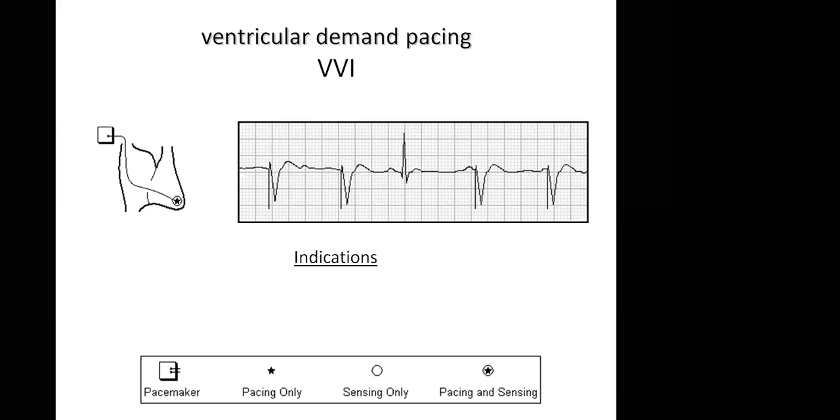The P, okay, there's something about this P. The first, did I get it right? Okay, the first PR interval is quite prolonged before the next pacing. Before the refractory, before the intrinsic activity. And then the next one after the intrinsic activity is closer to the QRS than the first one. I think I missed it up.